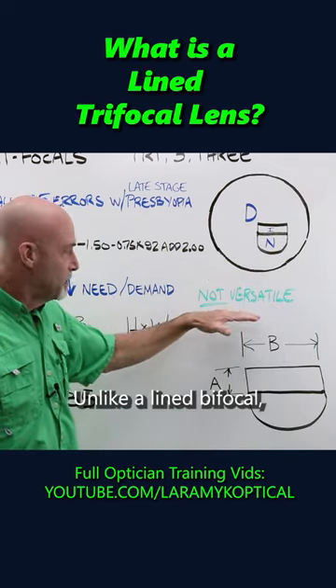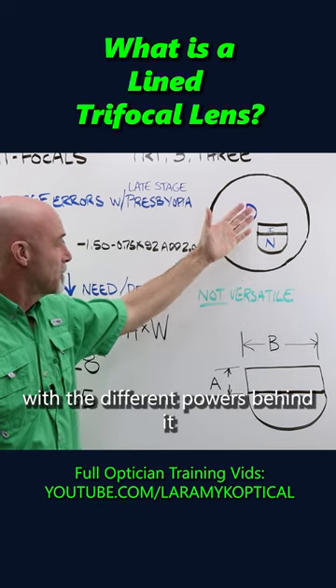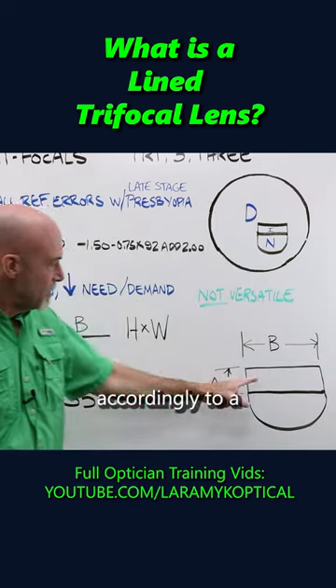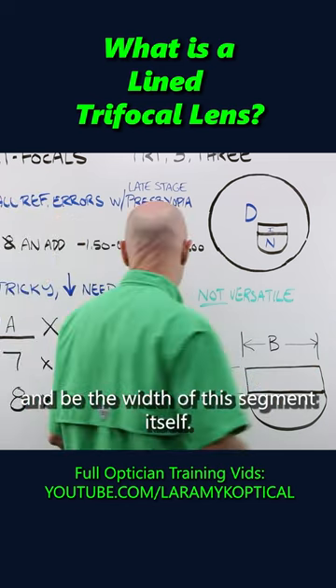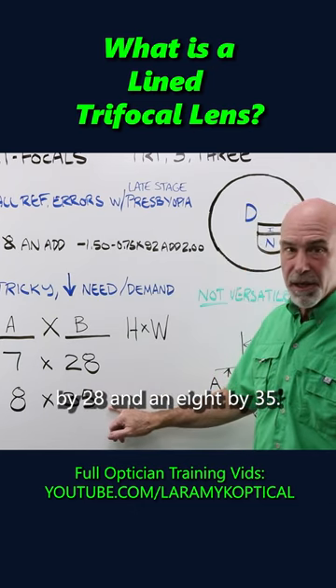Unlike a lined bifocal, they are not versatile. You can't play much with the different powers behind it, moving the segment around or anything. They are sized accordingly to A, the height of the intermediate zone, and B, the width of the segment itself. There are two general sizes: a seven by 28 and an eight by 35.